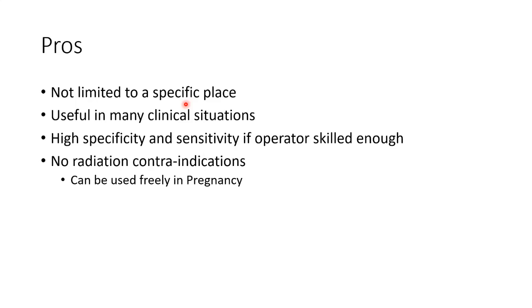As compared to that, CT and MRI are when you actually open the door and look into the shower. The person screams and you close the door. No, I'm just kidding. But that's the difference. So CT and MRI give you much more information, but they are also far more invasive. Higher radiation levels, more contraindications. I mean, PET scan now. So ultrasound is something that every clinician can use. All right.